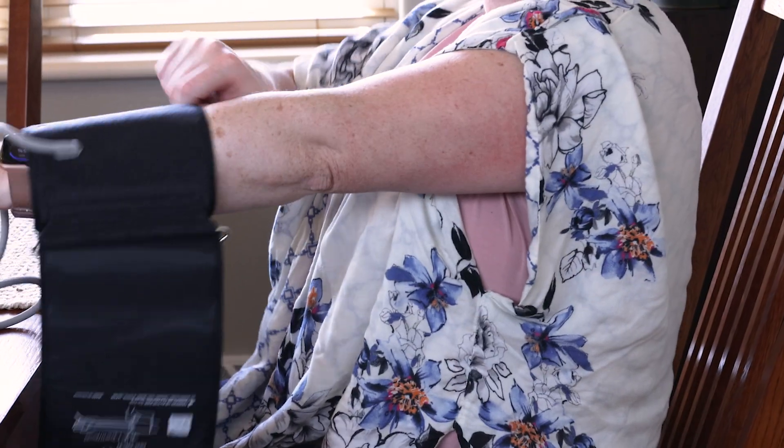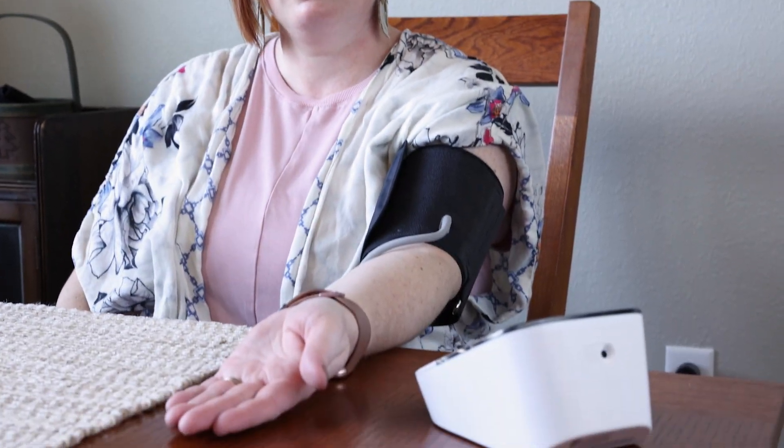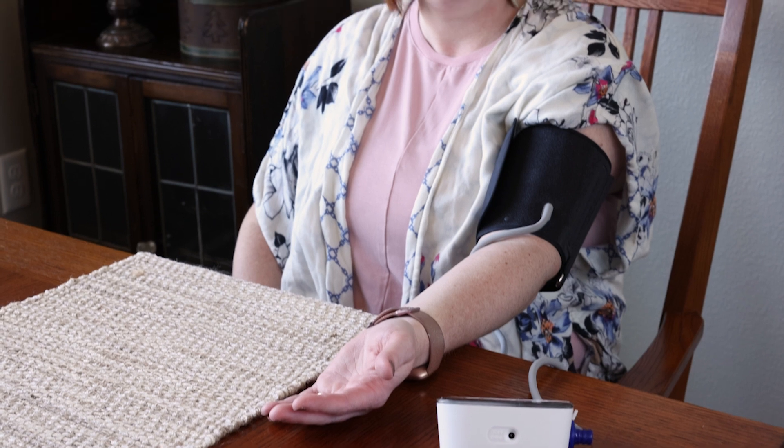Step 3, put your blood pressure cuff on your upper arm. And Step 4, do not talk or move while blood pressure measurement is in progress.